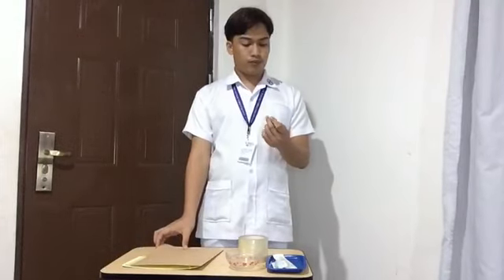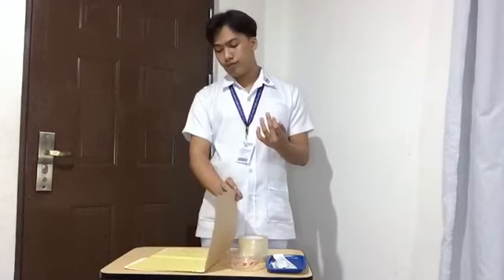Next is follow the 3 checks for administering medication. Read the label of the medication. First is when it is taken from the medication storage. Second is before withdrawing the medication. And third is after withdrawing the medication. So next is organize the equipment. This is to save time and energy.